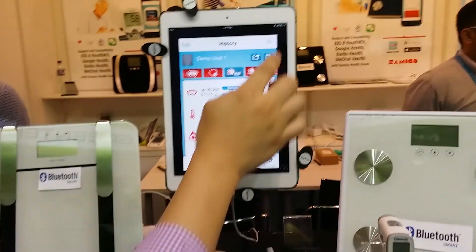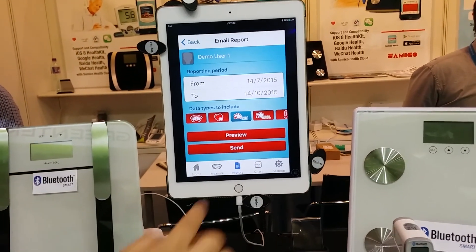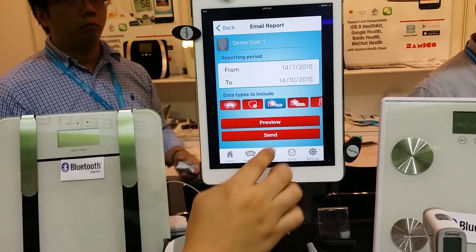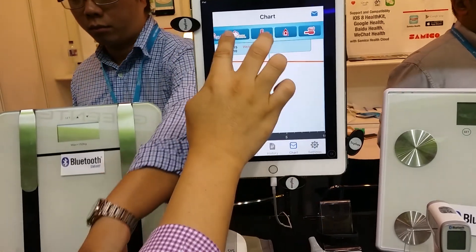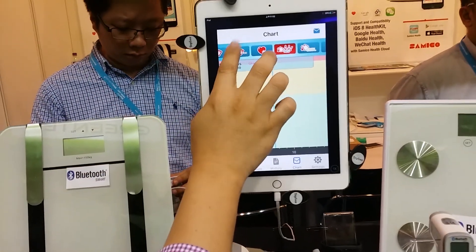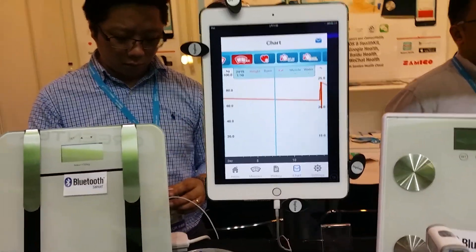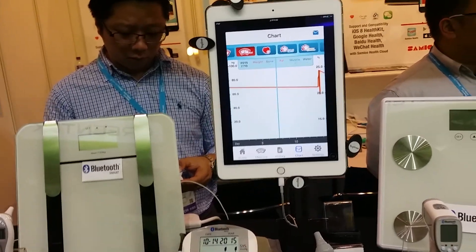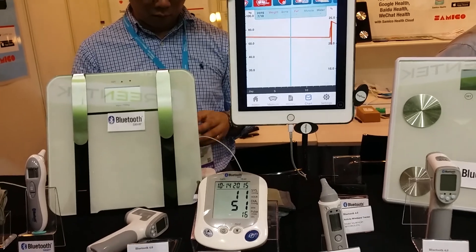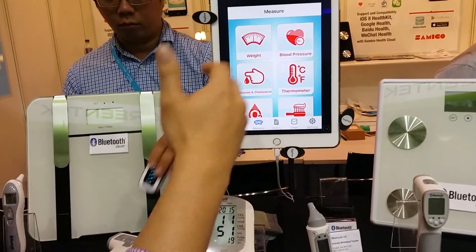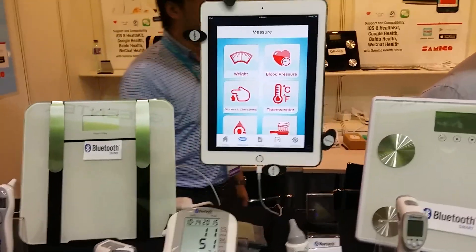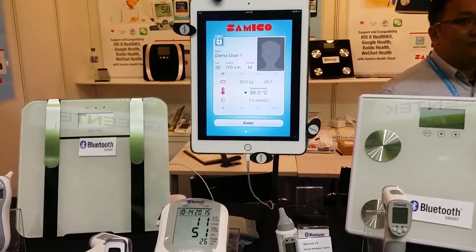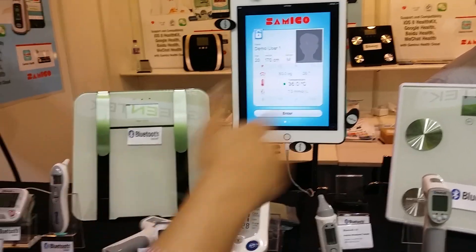And then you have a history. You can, for example, send your report to your doctor, with a chart here. A simple e-health — from the app, you can send it to the doctor, right? Yeah. Monitoring your health by yourself is also good. Excellent.